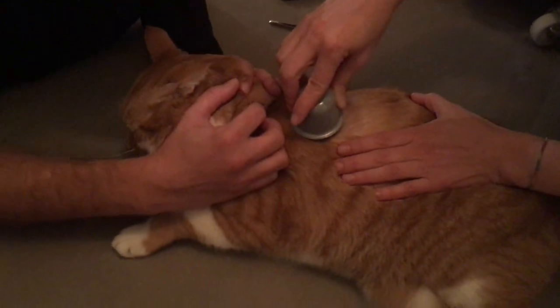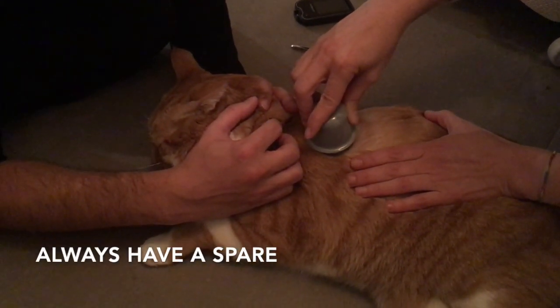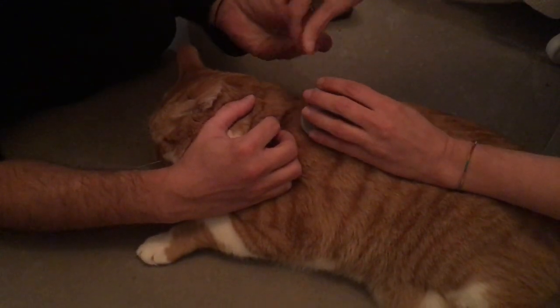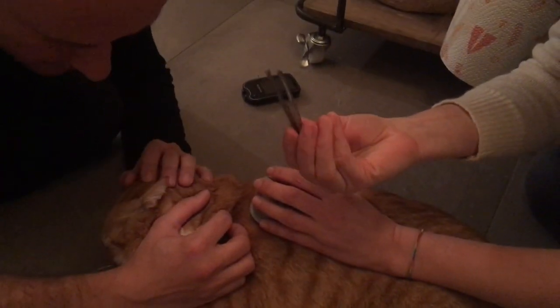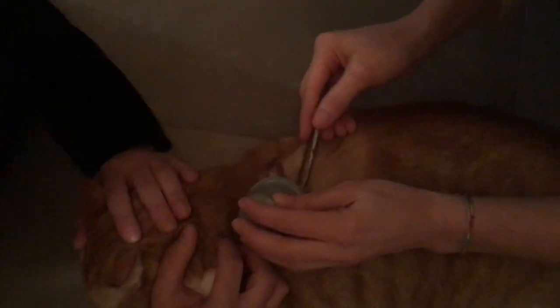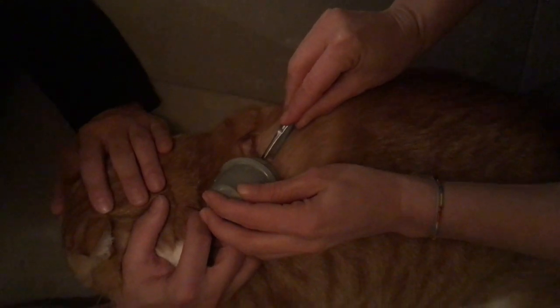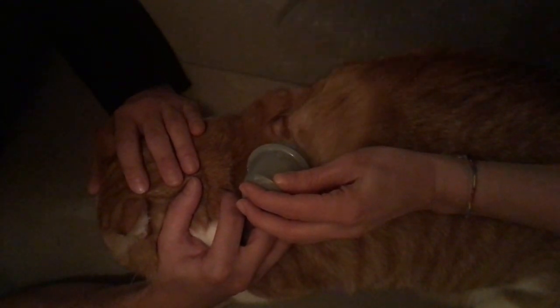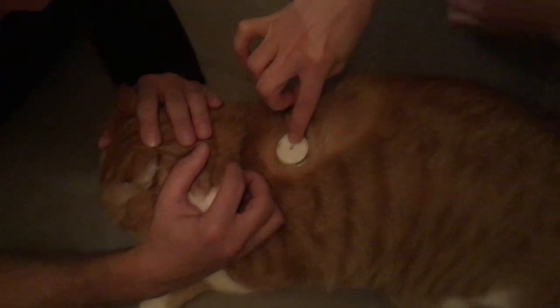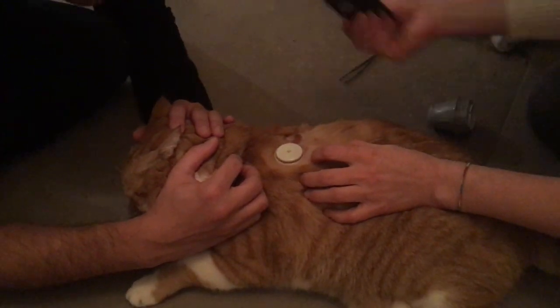These sensors last up to 14 days, sometimes less. This is to make sure the sensor doesn't come off. There we go, it's in place. Sometimes they don't last the full 14 days, so you have to be aware of that.